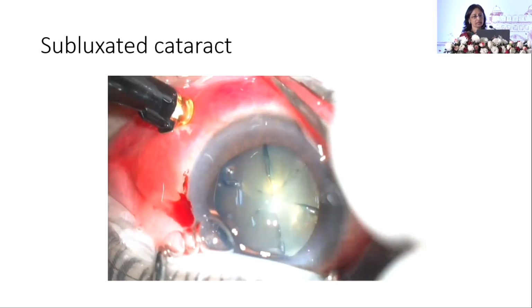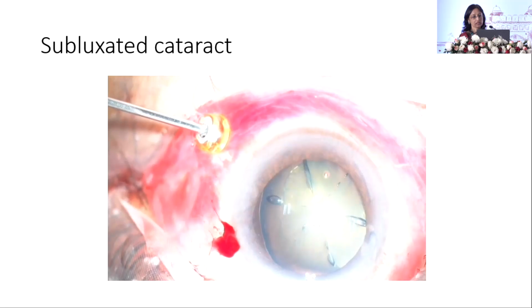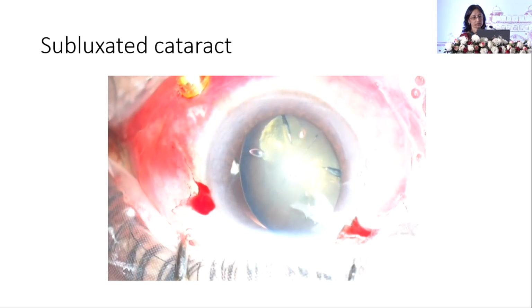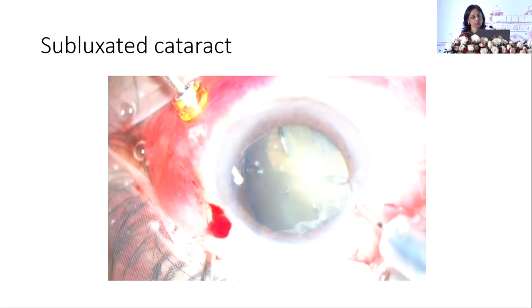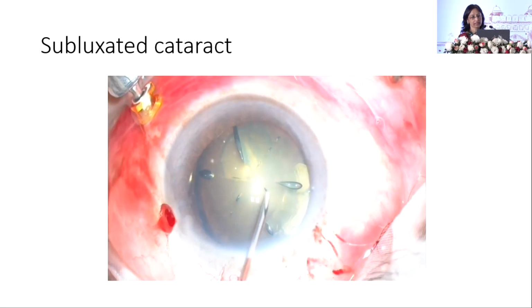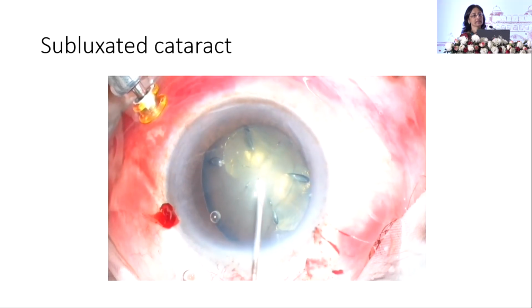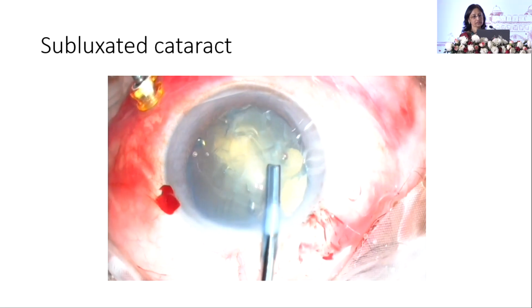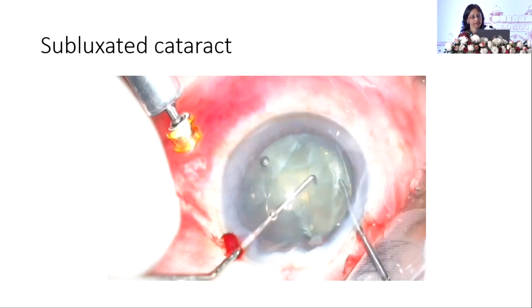So we do a limited dry vitrectomy, where we remove the vitreous in the area of zonular dialysis. I'm just putting triamcinolone so that we don't touch the posterior capsule accidentally. So it's just clearing the vitreous, whatever is there in the area of zonular dialysis. Then I proceed with the removal of the capsular cap that is already cut by the femtosecond laser. Secure this capsular tension ring in position that stabilizes the capsular bag.